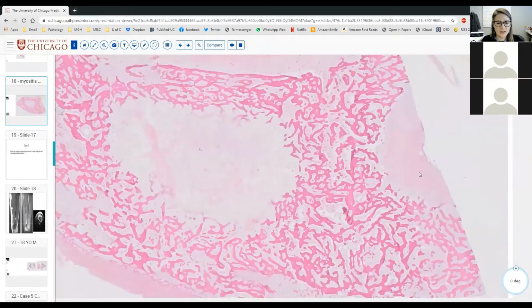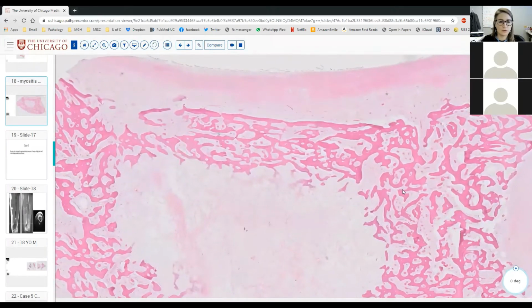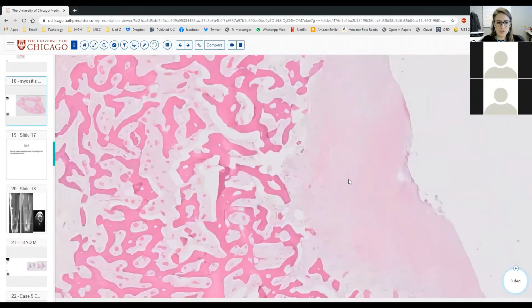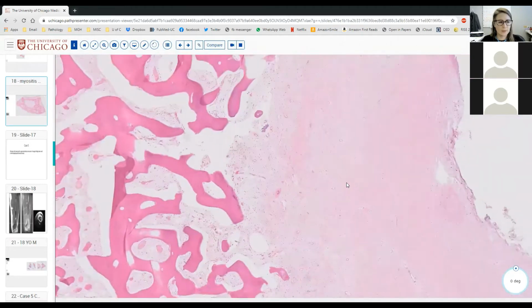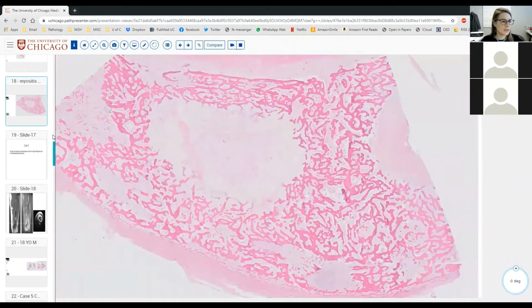In this case, on the resection, it was very bone rich and fibroblast poor, but that's okay, that happens. I wanted to share that with everyone because we don't really see these resected very often. So it's going to be in this presentation. After we've done all 10 cases, I will send out the link to this full presentation with the IHC and with the resections, as well as, of course, the recordings will be on the YouTube.